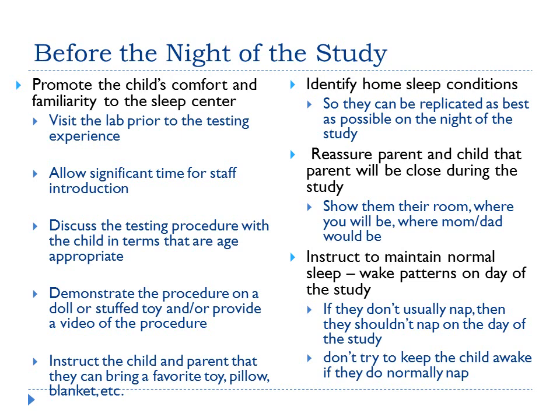You want to reassure the parent and child that the parent will be close by during the study. Show them their room, show them where mom and dad would be. In some instances, mom and dad may stay in the room. The only problem is having the parent sleep in the bed with them. That's highly discouraged because you're going to pick up artifact from mom or dad moving in the bed and whatnot. But they can sit in the room. There can be rocking chairs for them, or maybe even another single bed that they could sleep in, just to make the child comfortable. It kind of depends on the age of the child, but again, our focus is to make the experience pleasant for the child and comfortable.